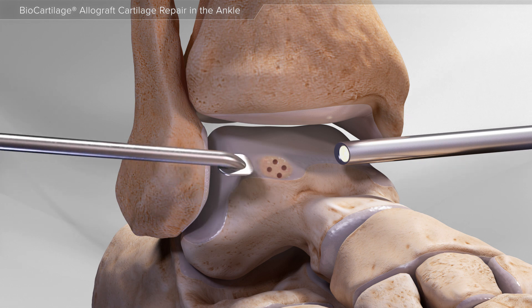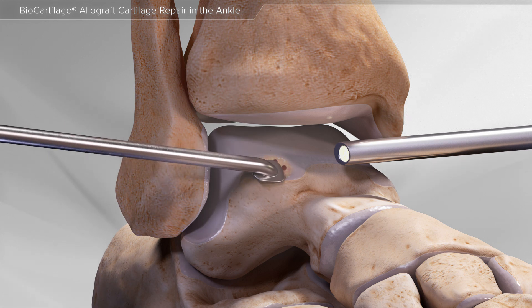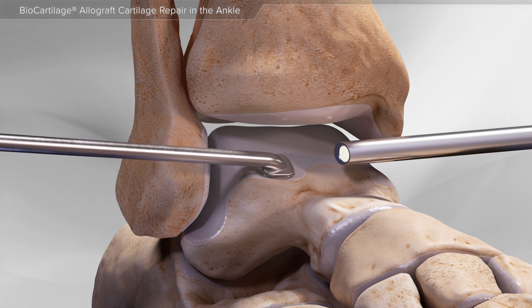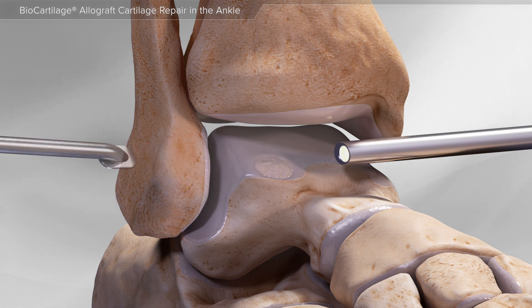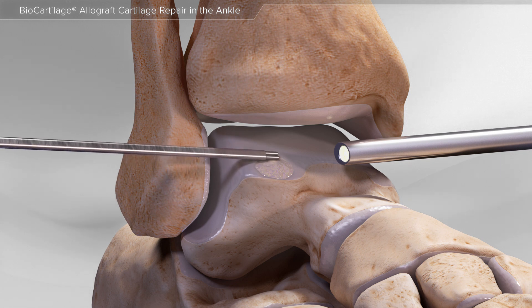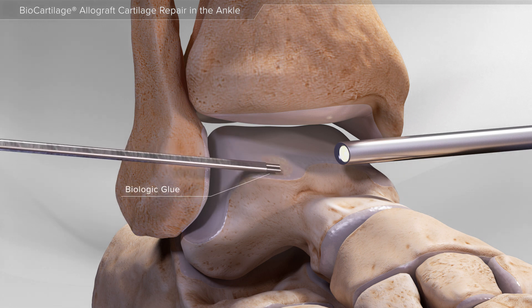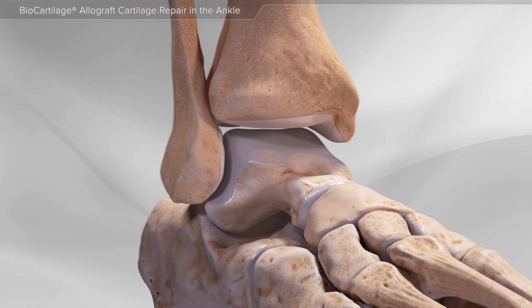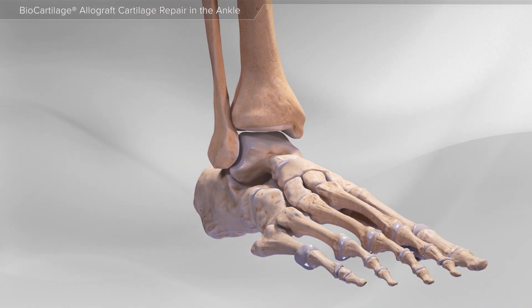The area is then dried and the biocartilage matrix is applied into the defect and smoothed with a special instrument. Next, a thin layer of biologic glue is used to seal the biocartilage matrix into place. This completes the cartilage defect repair of the ankle using biocartilage matrix.